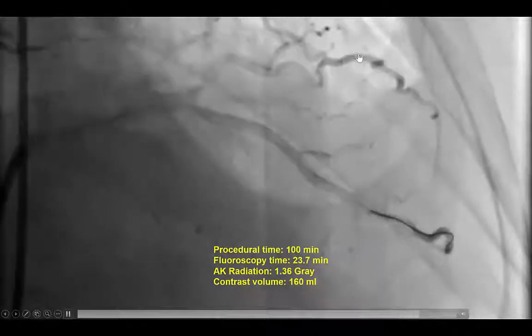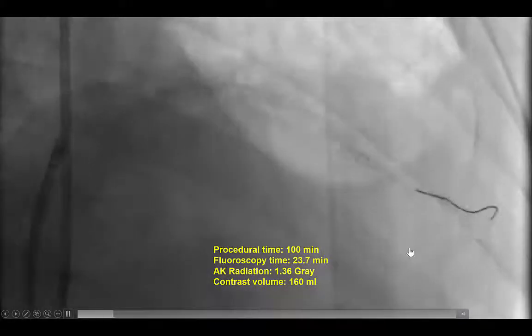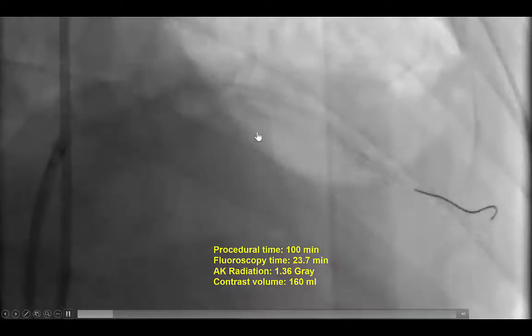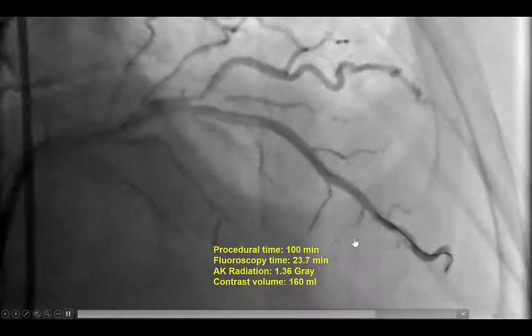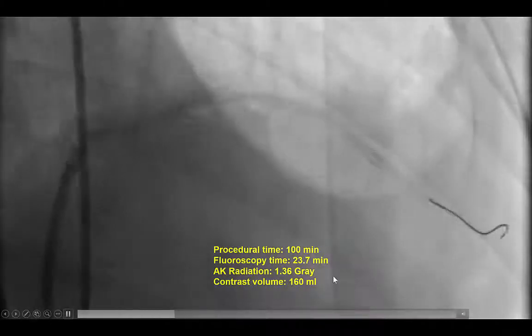This provided a nice final result. There was no compromise of flow in the diagonal branch, and there was excellent TIMI flow all the way in the distal LAD. Interestingly, even the septal branches that were jailed with the wire, including the septal in the subintimal course, were patent at the end. Procedural metrics: 100 minutes procedure time, less than 2 hours, 24 minutes of fluoroscopy time, 1.4 gray of radiation, and 160 mL of contrast.